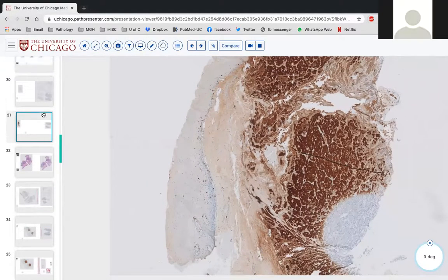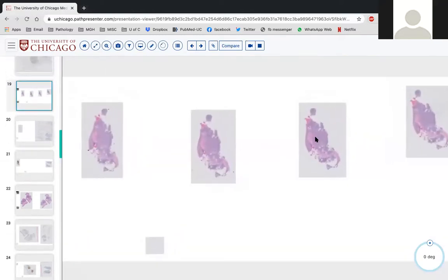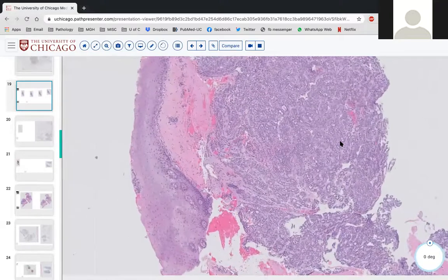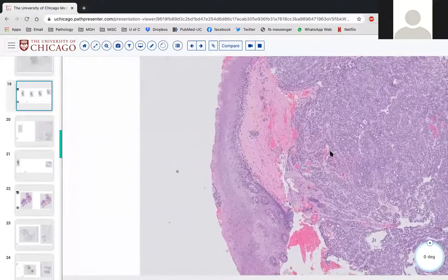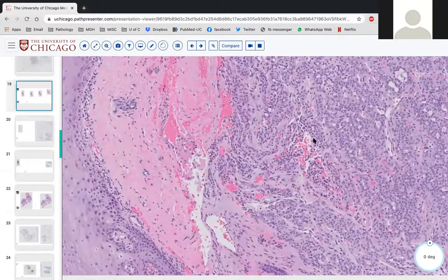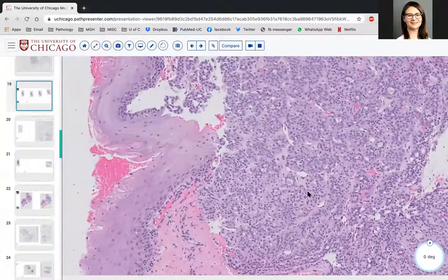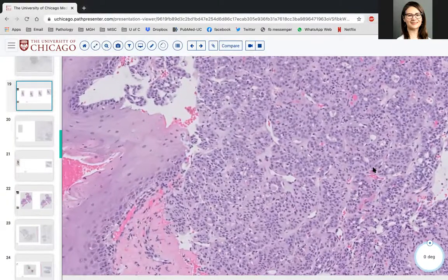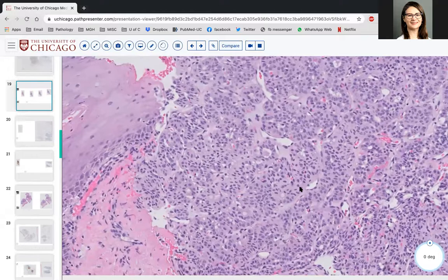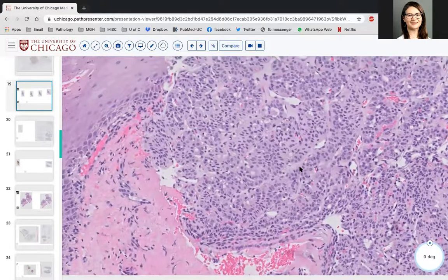I think it kind of fits with this picture. We have a single cell type. We have this super positive S100, and then there's no staining for P40. So I think all of that supports that as part of the differential. Absolutely. And the polymorphous is so called because it can have polymorphous or heterogeneous architecture, but a monotypic cell type, unfortunately.